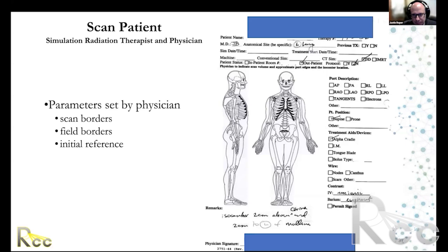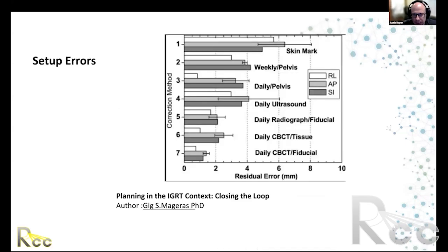Next slide, please. So when transitioning from 2D based radiotherapy to 3D based therapy, which is really the focus or the intent of this seminar series, there is the opportunity to tighten down fields, to shrink those margins, and thereby spare healthy tissues to a greater extent while still adequately covering the target.